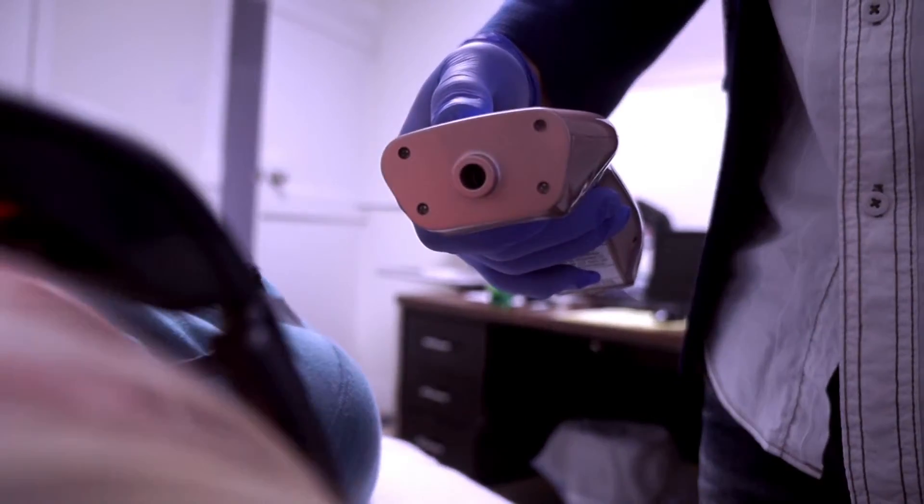Remove the safety cap, then press the on button on the laser to begin the treatment.